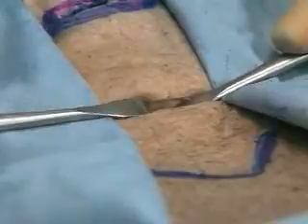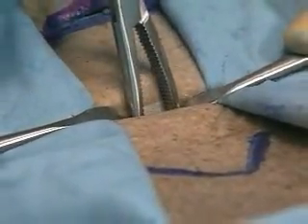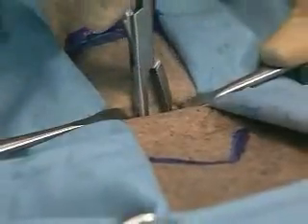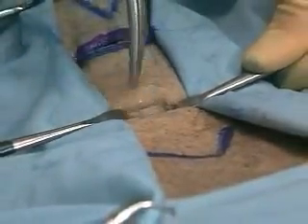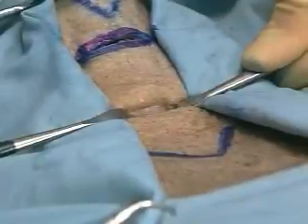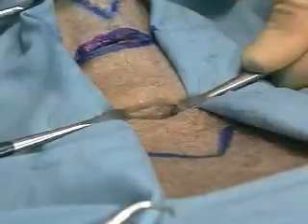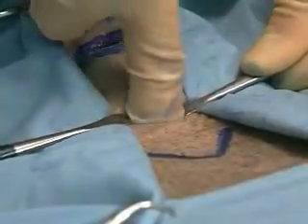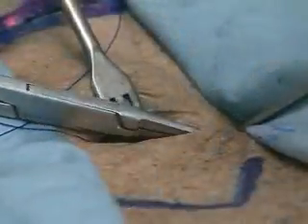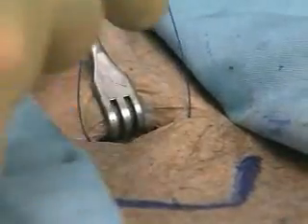Strap muscles are separated vertically or transversely, and the tissue between them is divided. The thyroid isthmus sometimes needs to be retracted inferiorly or divided. The trachea is identified and separated from the surrounding tissues, so the 2nd to 4th tracheal rings are identified. 2 stay sutures are then placed in the trachea at the approximate level of the 2nd or 3rd tracheal ring.